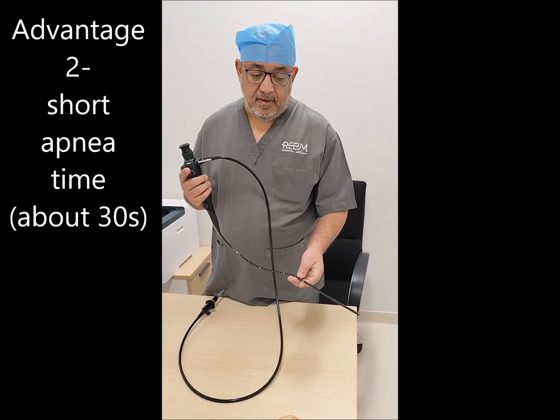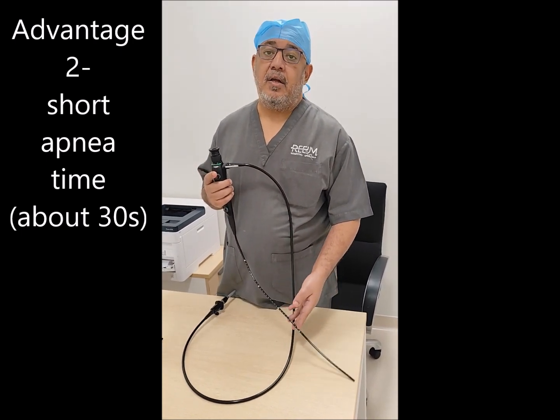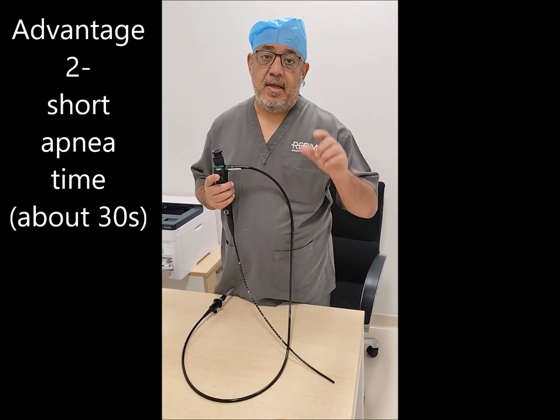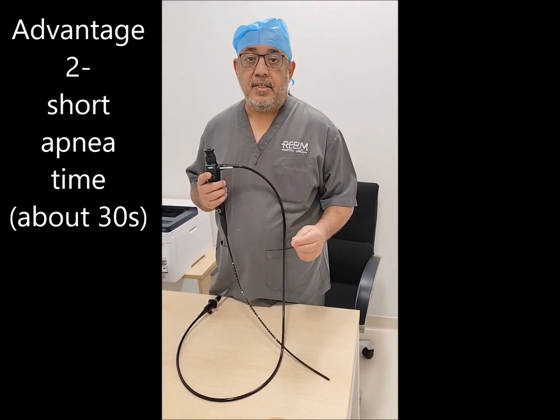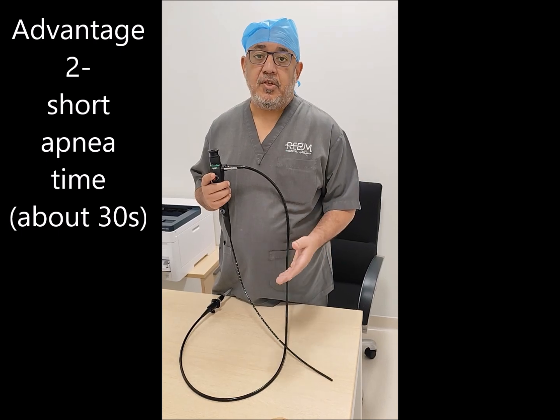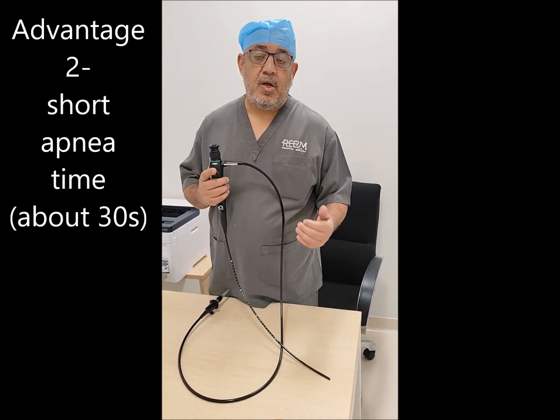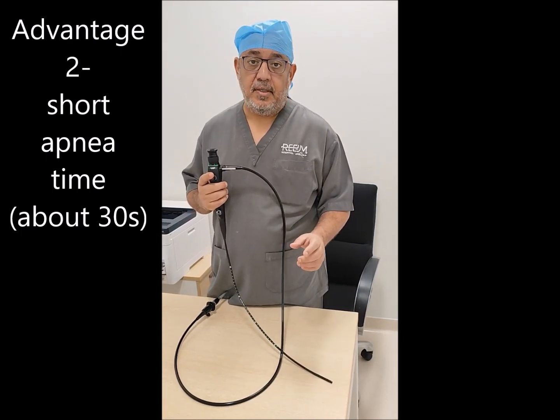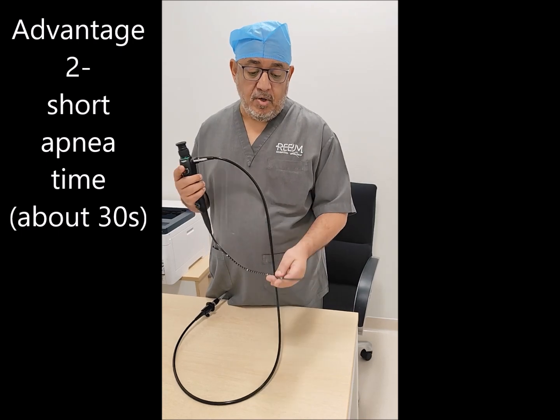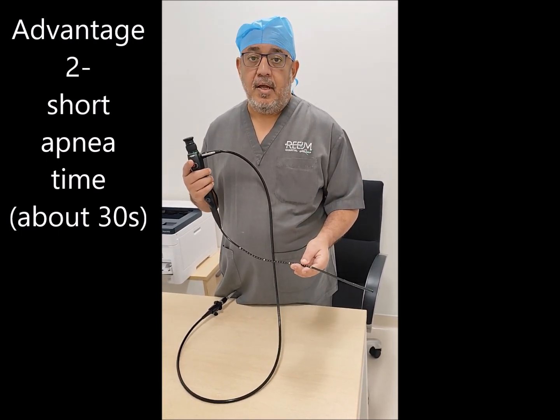The fiber optic also has a very important advantage: it shortens the intubation time, and therefore the apnea time is also reduced. This is very important especially in obese patients, because most patients with a high larynx are morbidly obese, and these patients have high oxygen consumption and desaturate very rapidly. So decreasing the apnea time when using fiber optic added to the video laryngoscope is a critical benefit.